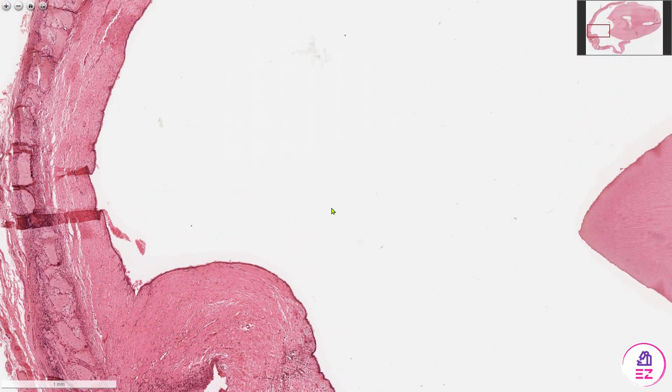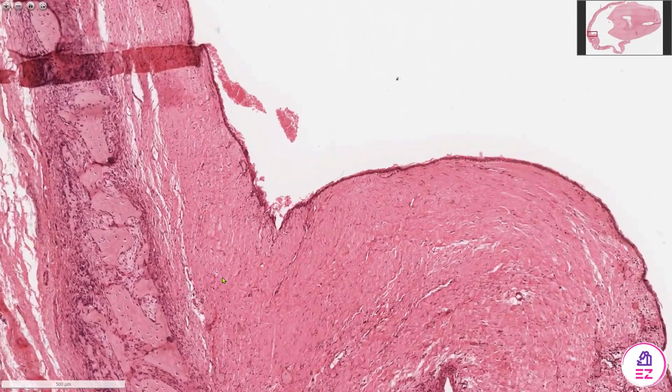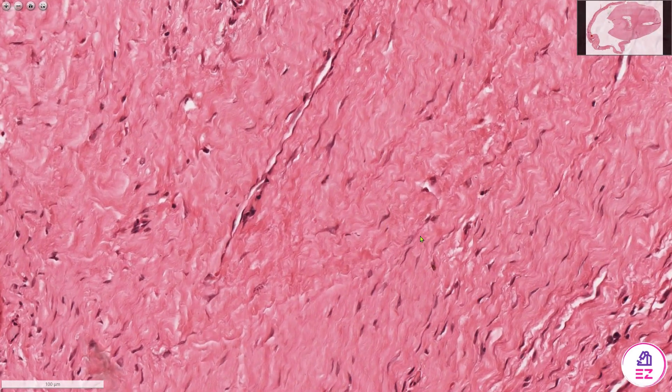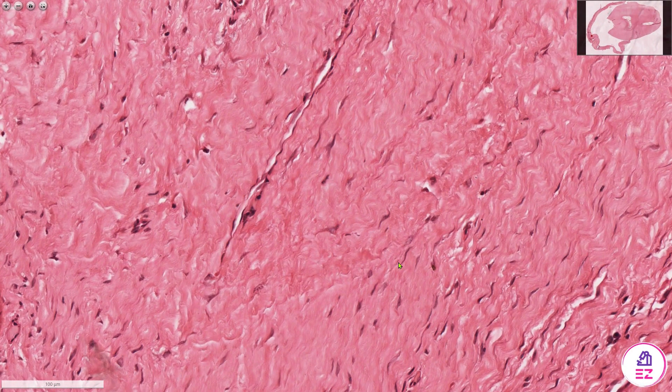We have a lining and a lumen. So if we look at the wall of the cyst to begin with, it's very fibrotic. These wiggly cells are probably fibroblasts, but I'm not seeing extensive inflammation like I did in the radicular cyst.